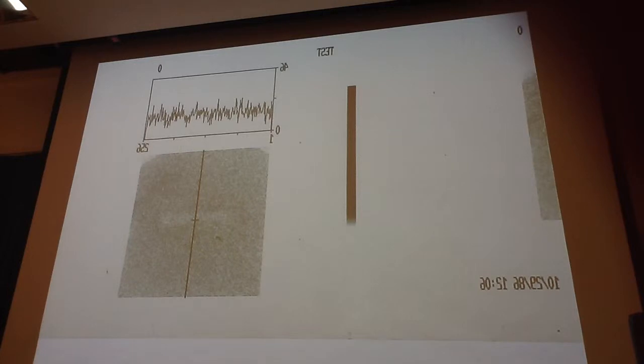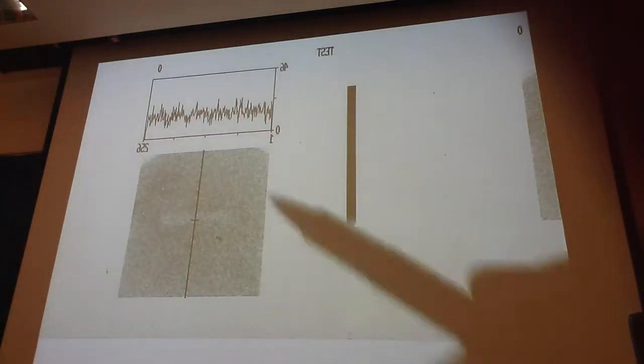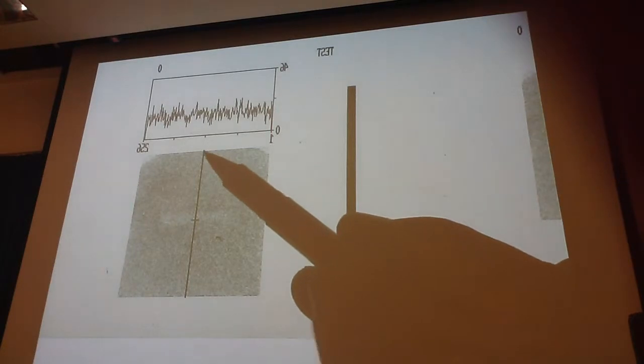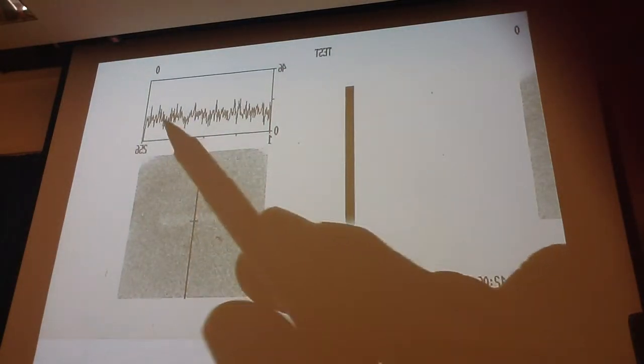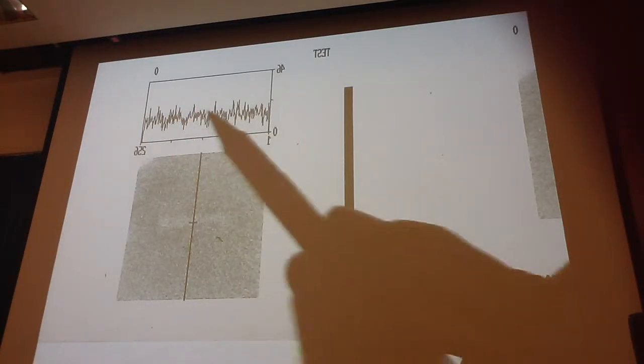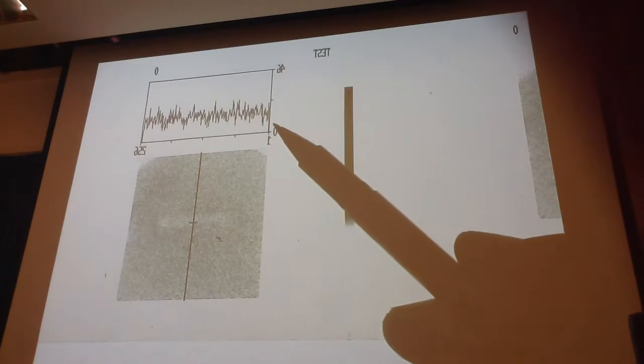Well, see, when I don't have enough information, I'm losing it. It's actually still in the center. You're actually starting here. This up here corresponds to over here. I go down, so as you're going through, the object should be right around here somewhere, but this is lost in what we call noise.